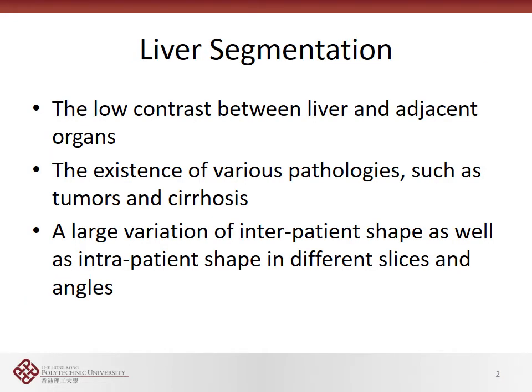So next, we introduce some deep learning models proposed by our group to deal with some challenging medical image segmentation tasks. The first application is liver segmentation from 3D CT images. It is a very challenging task due to the following reasons.